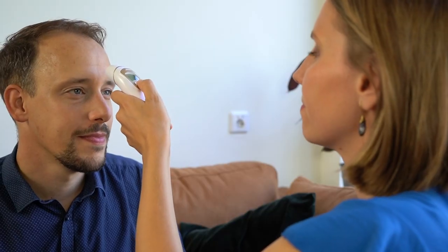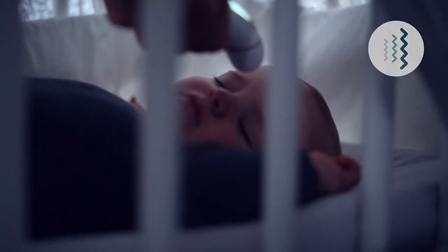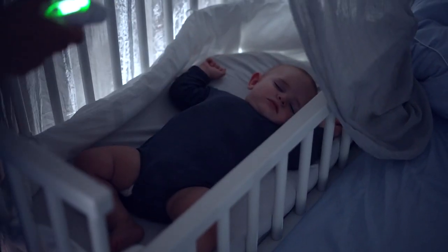The upgraded fever alarm gives indications not just for fever, but also for hypothermia. Never miss an alert or reading with a gentle vibration instead of a beep, which will allow your child to keep sleeping.